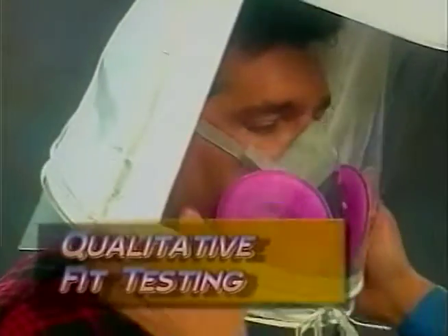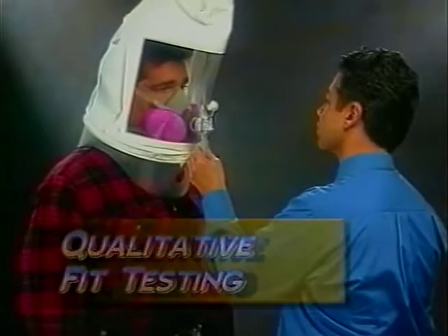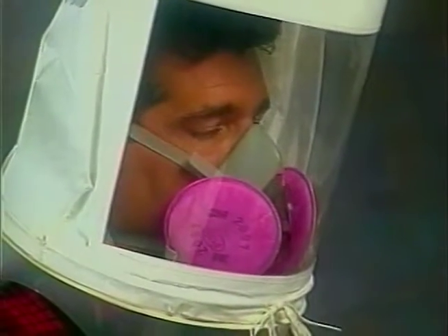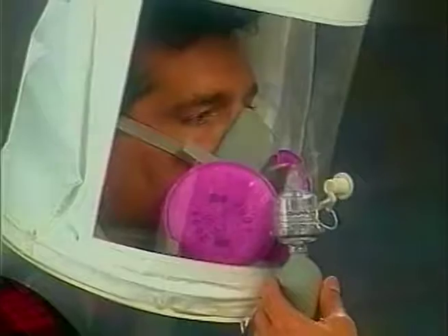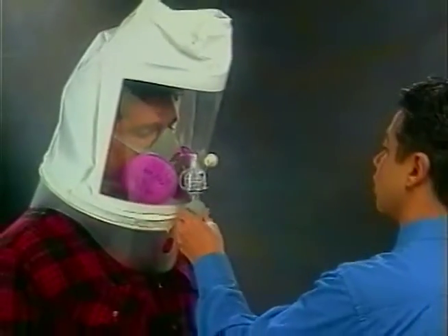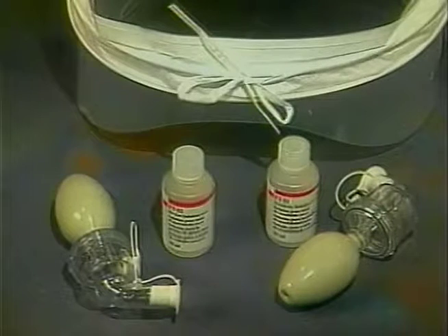Qualitative fit testing is a simple pass or fail test that relies on an individual's response to an airborne test agent. Except when irritating smoke is used, the test agent is in most cases released inside a hood or an enclosure while the test subject wears the respirator. If the worker cannot detect any penetration of the test agent into the respirator, then it is assumed that the respirator seal on the worker's face is acceptable. This is a subjective test which relies on the ability of the test subject to smell or taste the test agent. Qualitative fit testing equipment should be available from your respirator supplier.